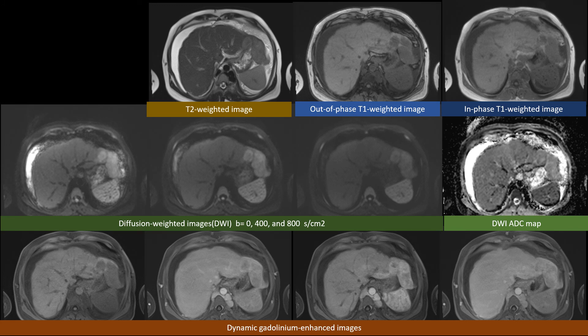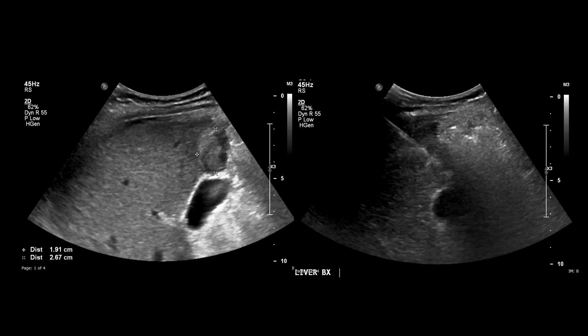The same applies for the lesion in the left lobe. We see it in the pre-contrast phase; its enhancement is more delayed than the right lobe lesions, enhancing on the second image after injection of contrast medium. We can see that the lesions are in fact three, and then they wash out. Ultrasound-guided biopsy of the lesion close to the gallbladder proved hepatocellular carcinoma.